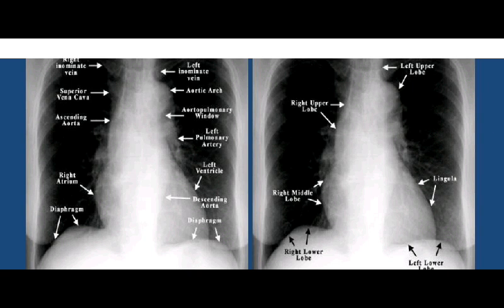when you want to identify a pathology, or even if you want to identify a normal radiograph. It's very important that in imaging critics you identify these structures. Why? So you know how they appear normally, so that when there is a pathology, you can actually say, okay, yes, this is a pathology. This is not how the aorta is meant to look, maybe in terms of aortic unfolding or any other pathology in the lungs, or if there is a mass in a particular part of the lungs, you can actually locate where that pathology is. Do you understand? So that is just it.